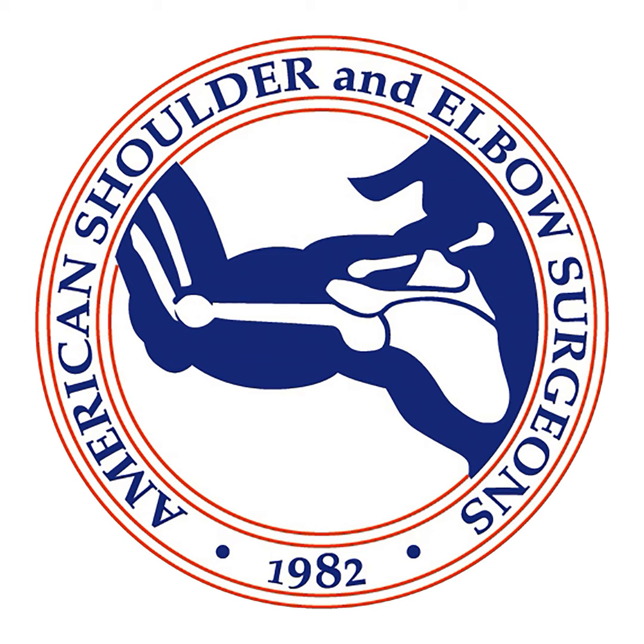The problem we kept seeing was that the humerus is heart-shaped. So it's wider up top, more narrow below. And there's a tendency for surgeons to put the stemless implant a little high on the humeral face because that's the widest part, because people want to avoid intraoperative fracture. But what was happening is we were seeing the humeral head then being placed too high, with associated cuff failure.